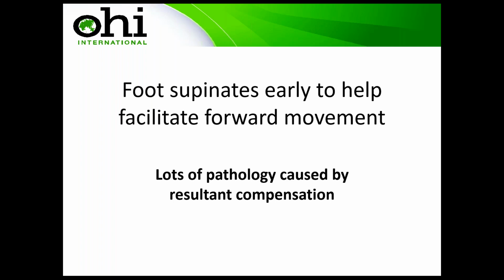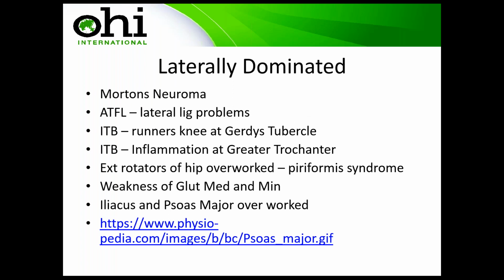So this is where we look at the foot and we go, contact phase is generally always inside. It's always medial. You've got medial shin, you've got medial heel, you've got the plantar fascia, medial part of the foot, you've got hallux abductovalgus, you've got all sorts of things, and medial knee. You've got all sorts of medial problems. Now we're going to move lateral, because when we have to externally rotate, we get all these laterally dominated problems. And I'm going to bring you back to the scan to show you after this.